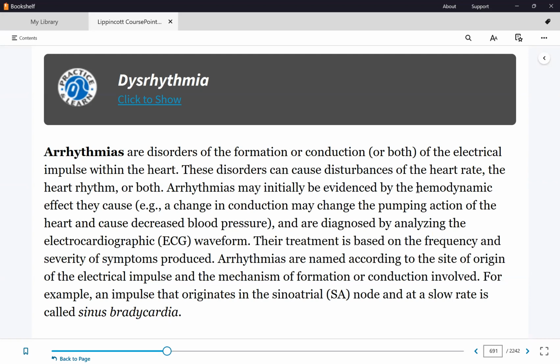There are different variations of a rhythm. When you look at one patient's monitor and another patient's monitor, they may not look the same, but it's the same rhythm. For fairness, I will only use strips that are in your textbook. Whatever strips are available in your textbook, that's what I'll use for your exam questions.